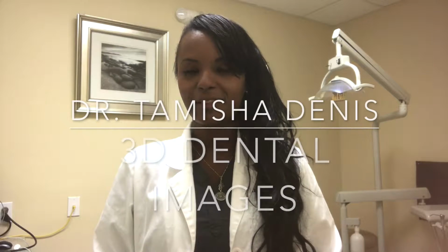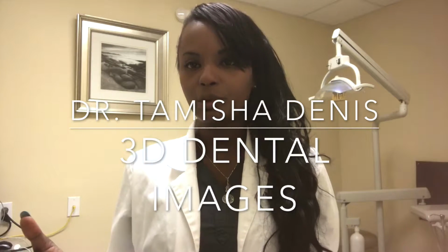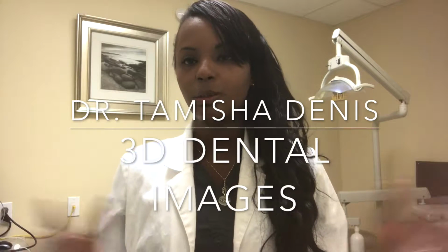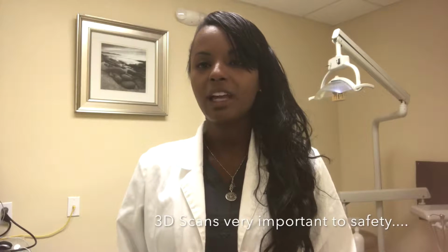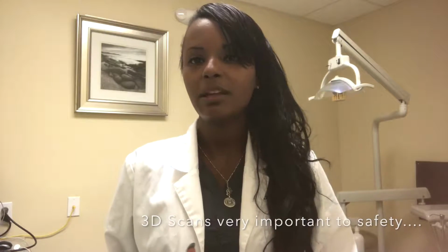Dr. Tamisha Denis of Modern Smile and Implant Center, and today I am in one of my operatories, and I'd like to talk to you about our dental 3D imaging machine, and also about what the images look like. So in modern day dentistry, we have the advantage of being able to see things in 3 dimensions.